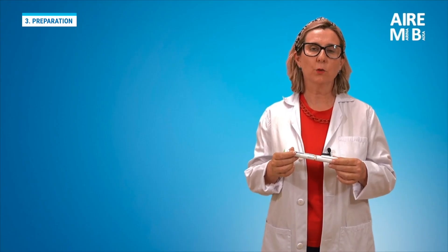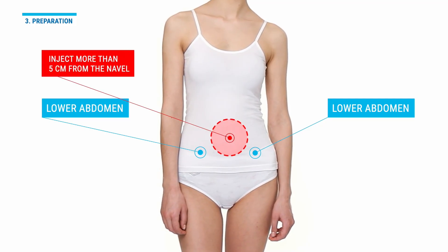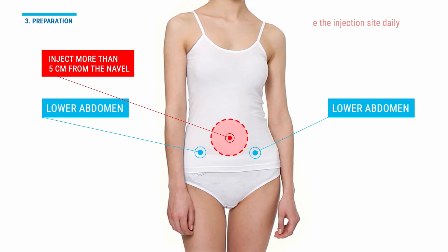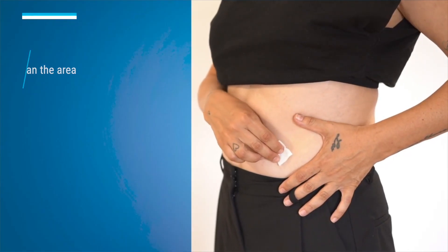We carefully choose the injection site — the lower region of the abdomen. Do not inject within approximately 5 cm of the navel. Each day we will inject in a different area of the abdomen. We carefully clean the chosen area with the gauze and do not touch the area again.